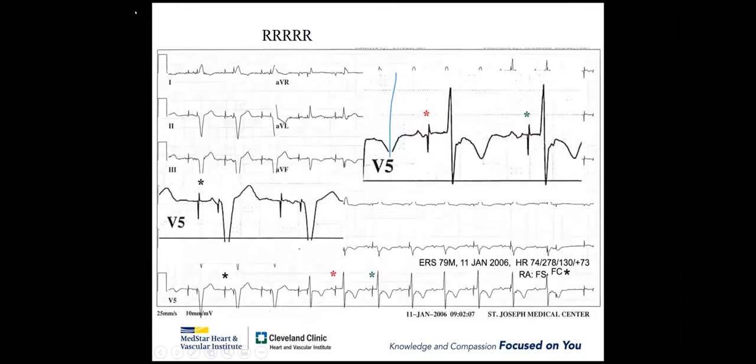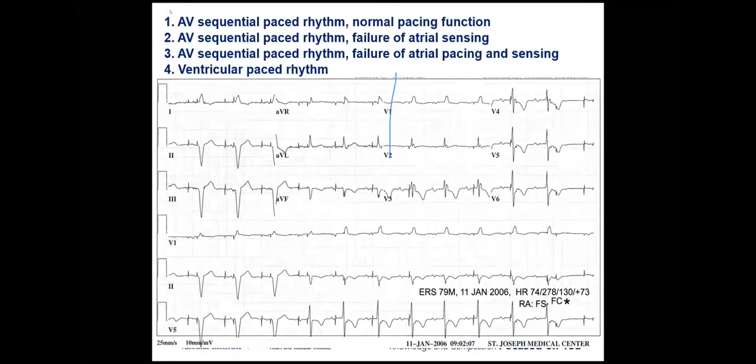So now that's a tough one, because the way you phrased it is failure of atrial pacing and sensing, but we are seeing atrial pace, ventricular pace, atrial sense, ventricular pace, but this is a little odd.